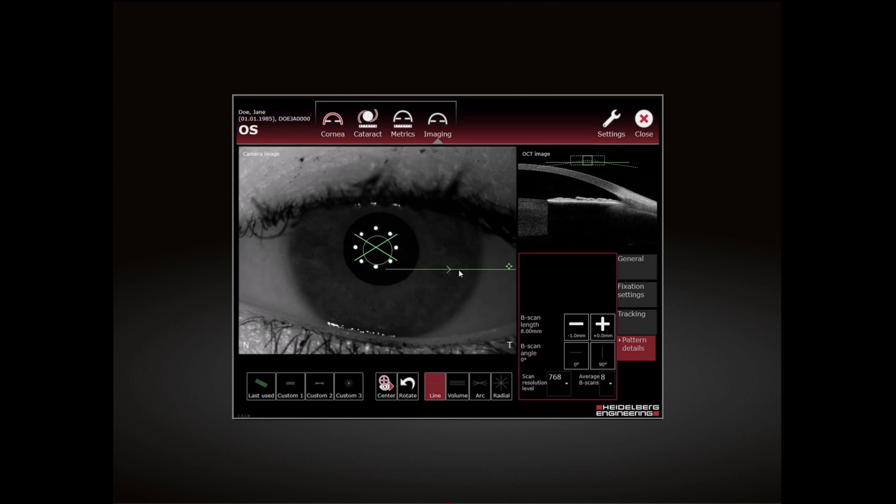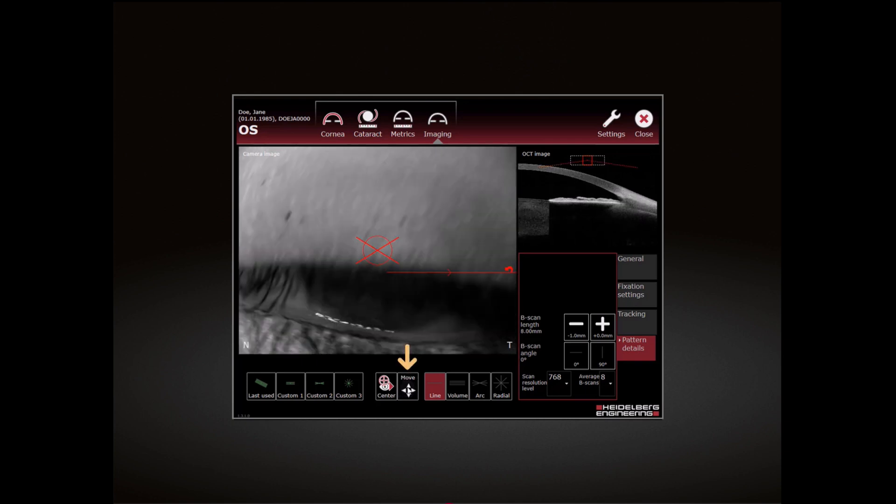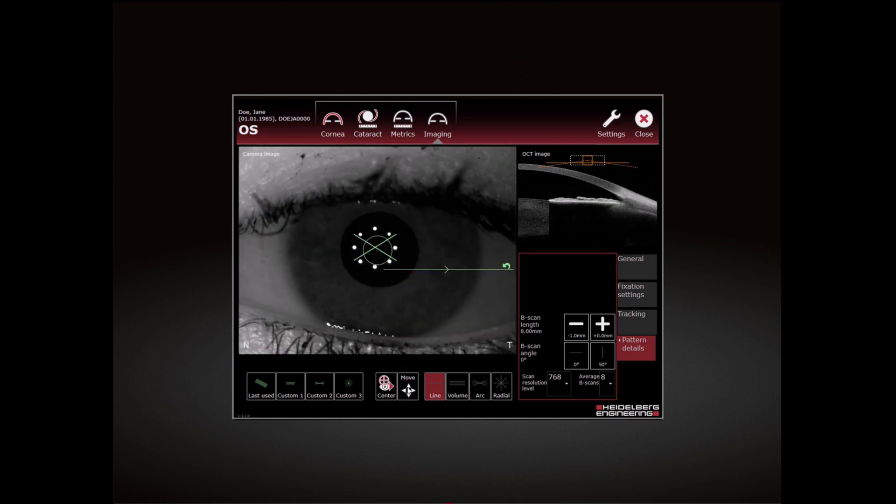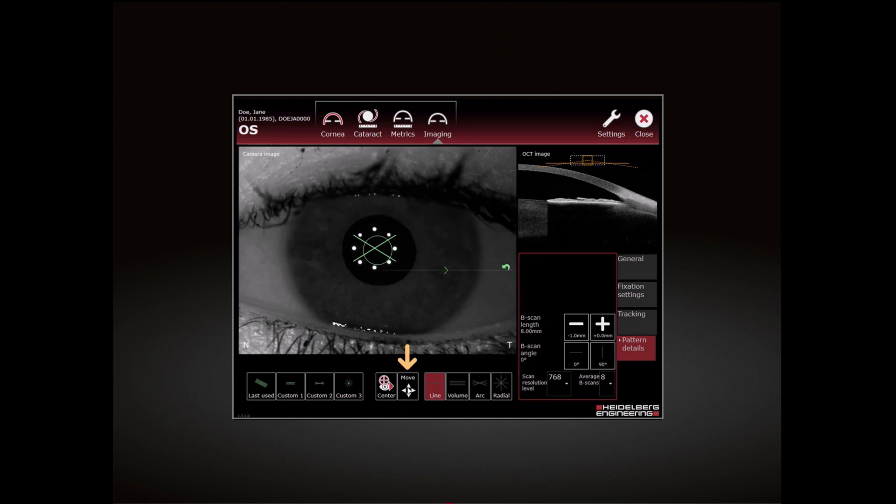To rotate the de-centred scan, tap Rotate. The Move button is now displayed. The symbol on the scan pattern indicates that rotation is possible.